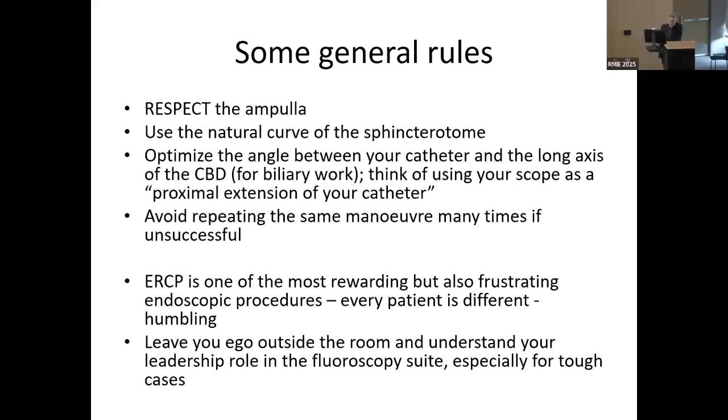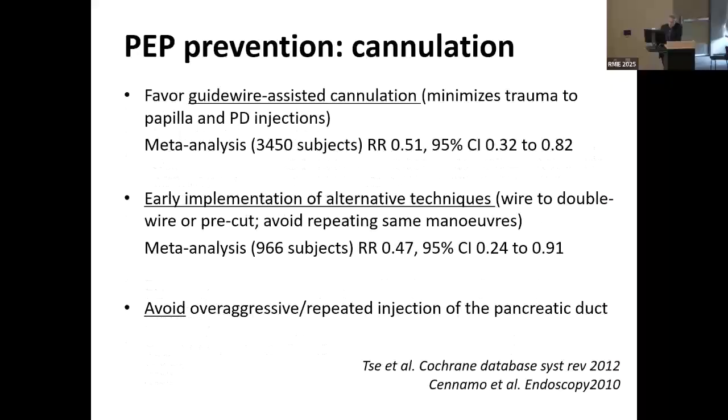We see this repeatedly, and it's a problem as the tension rises in the room. ERCP is one of the most rewarding, but also frustrating endoscopic procedures. Every patient is different, which is wonderful and extremely challenging, but it's also quite humbling. And you leave your ego outside the room and understand your leadership role in the fluoroscopy suite, especially for tough cases. This is true for biliary cannulation and ERCP in general. This is true for all that you'll do in interventional endoscopy. I think you've seen it and you've heard it repeatedly over the last few days.